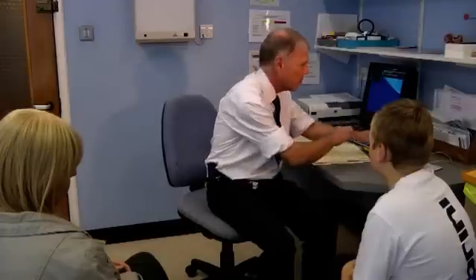Then I need to count slowly up to 10. To make it easier to slow down, some people add something like 'elephant', so we might say: one elephant, two elephant, three elephant, all the way up to 10. Then with the real device there would be a little needle here, and you would need to bend it over so it doesn't hurt anyone and put it carefully away. That would have injected adrenaline into the muscle and would help all those things we talked about.